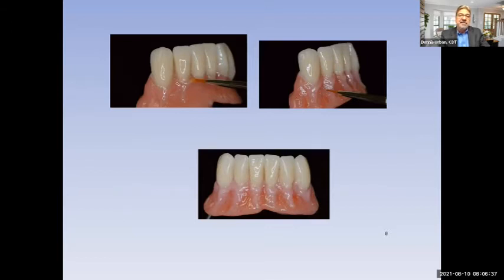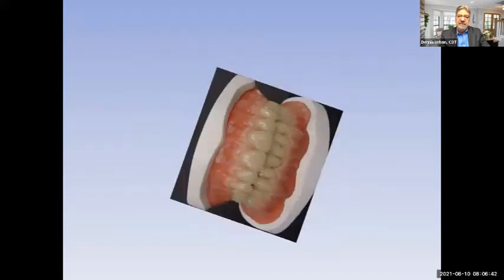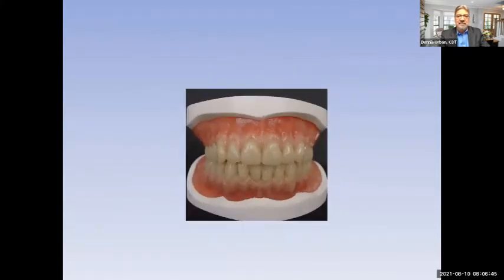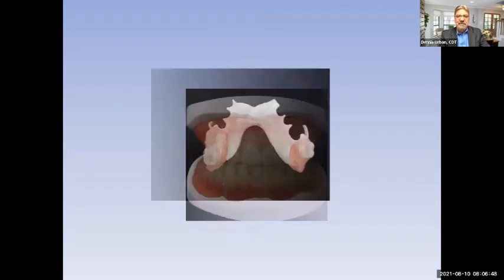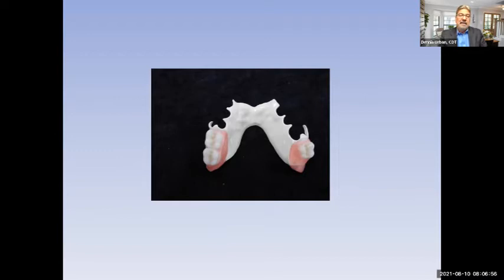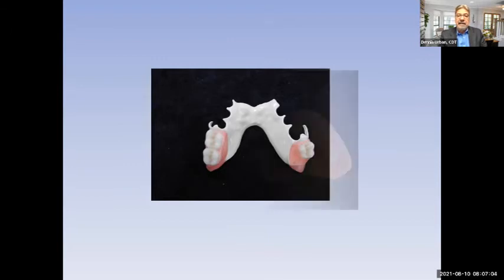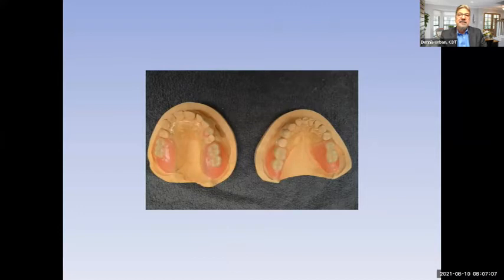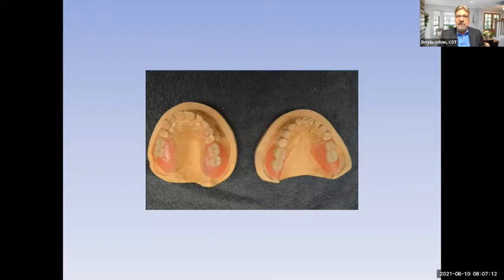With the denture acrylics available now, there are so many color variations we can pretty much match anytime. This is a dramatic photo of Vita physio-denture teeth with a characterized denture base. We've also come a long way with partial dentures — using digital technology and milling metal-free frameworks. This is a milled framework called Sauve, and we have clear dentures that virtually disappear in the mouth, so all you see are those aesthetic denture teeth with no metal clasp showing.